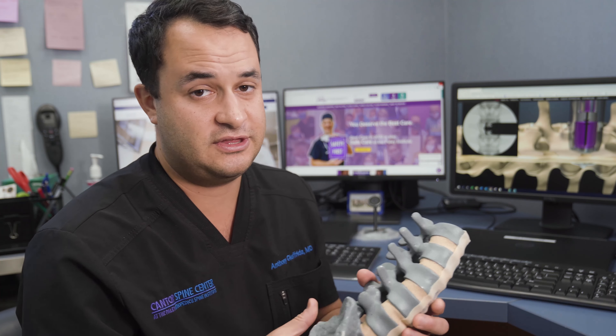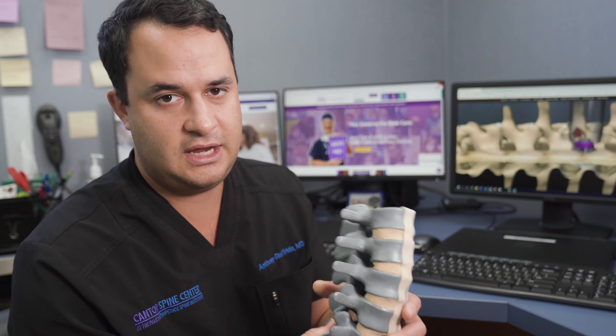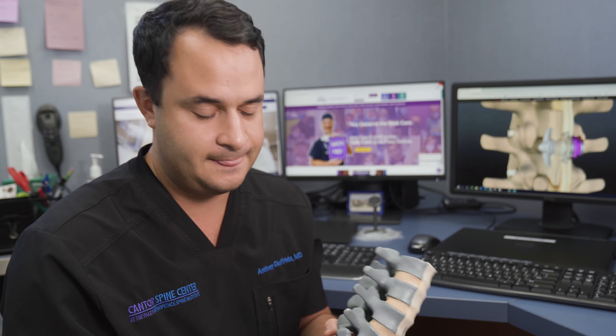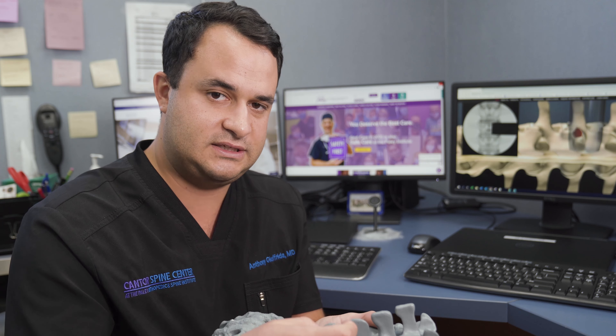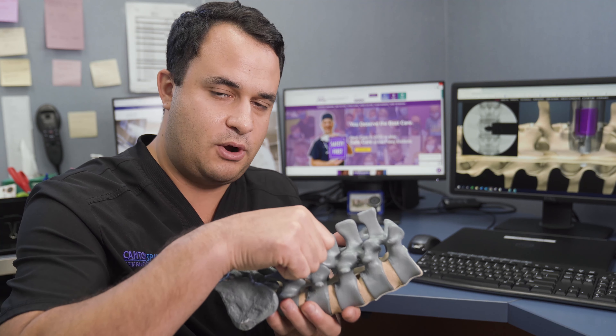When you have something called a spondylolisthesis, where the bone is actually riding on top of the other bone, it can cause severe back pain and pain down your legs with motion. So what we do is we go in from the side, put this little device in and deploy it, which gives us a nice posterior fusion.